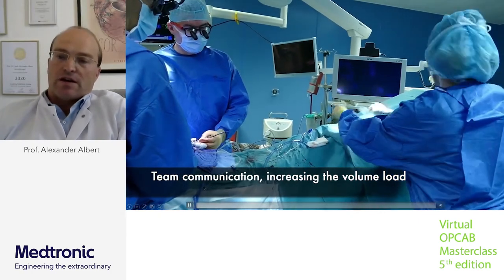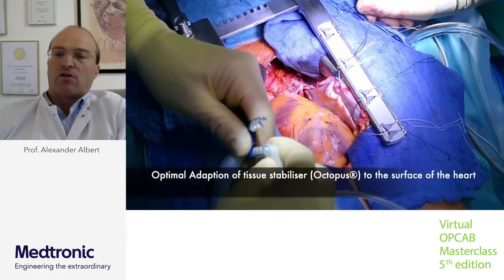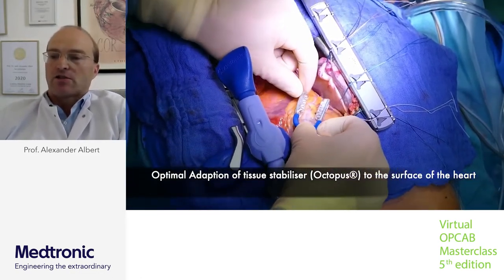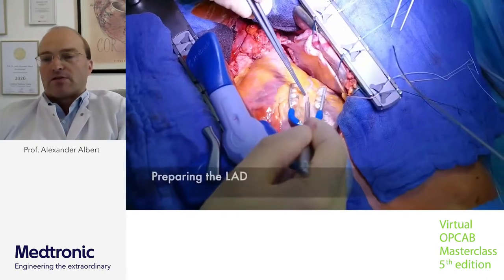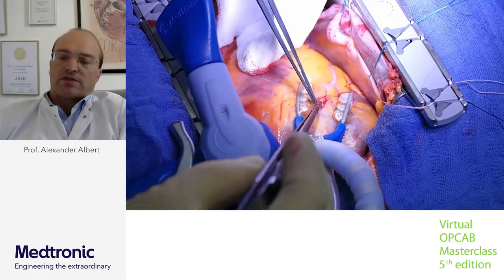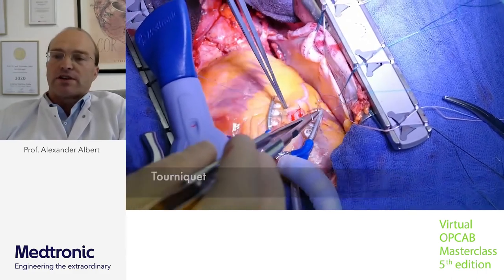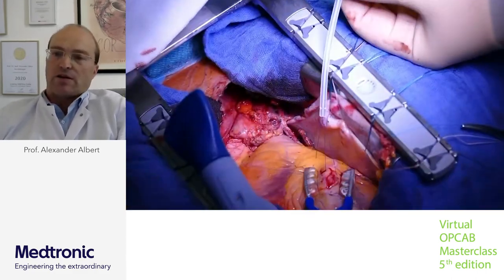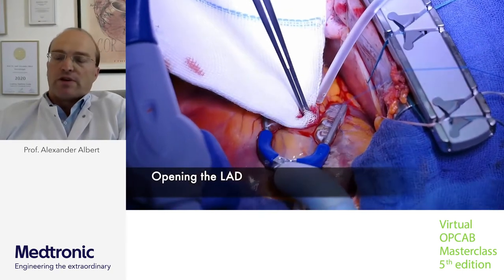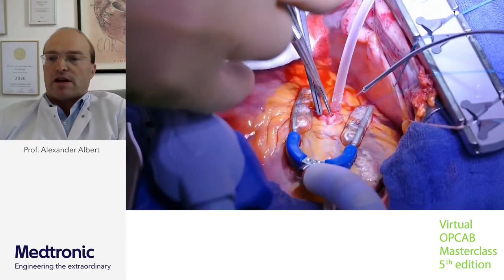We observed hypercontractility of the heart, so we increase preload by elevating only the legs — no Trendelenburg position. We adapt the tissue stabilizer, the octopus, to the surface of the heart. We don't want to push down the anterior wall, as this may cause stress and reduce heart function. We nicely expose the LAD with two everting stitches and interrupt flow only for a very short time. But before doing this, we again discuss with the team about the hemodynamic situation and patient condition.